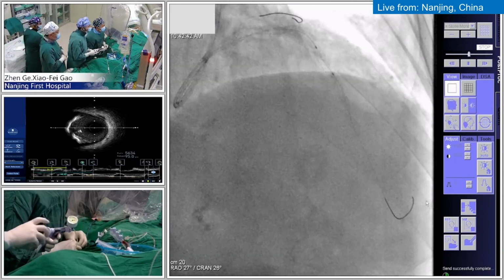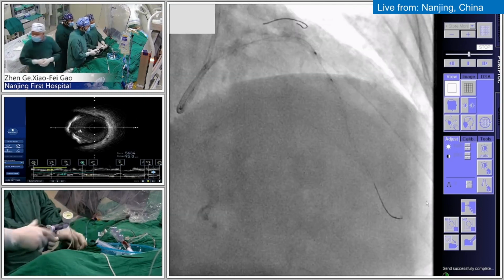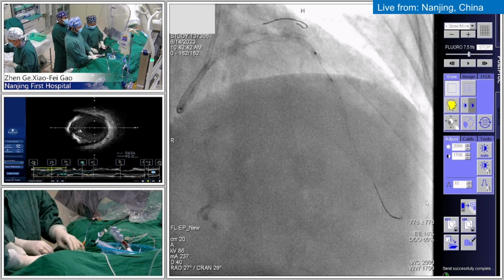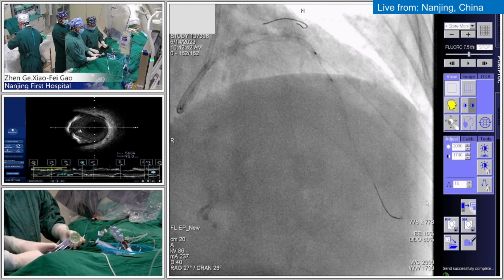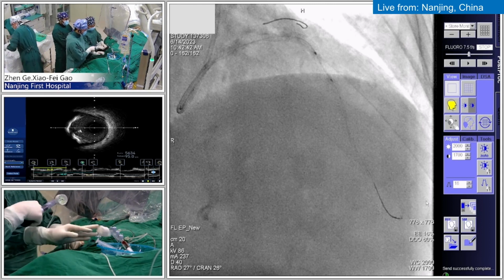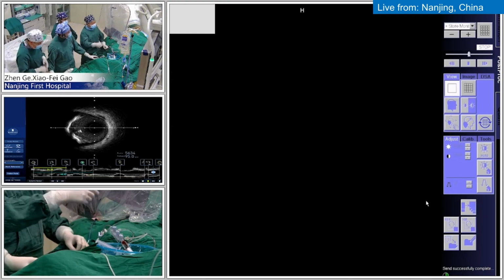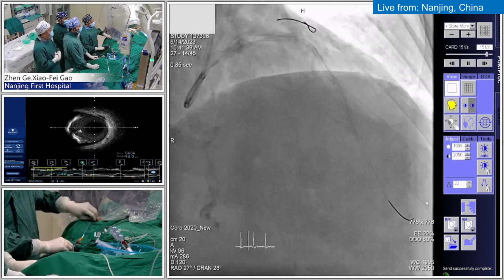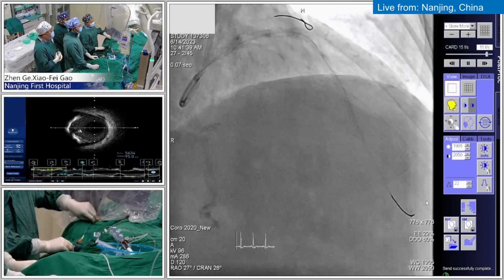Do you have any further plans which you want to discuss? Yeah, I already put the 3 stents from the distal LAD to the left main, and all of them look good and well expanded. Here I want to do the post dilation.